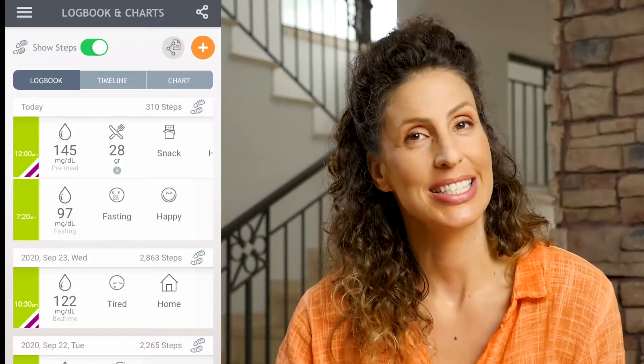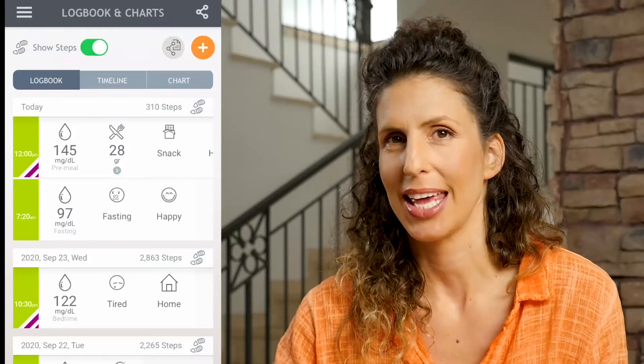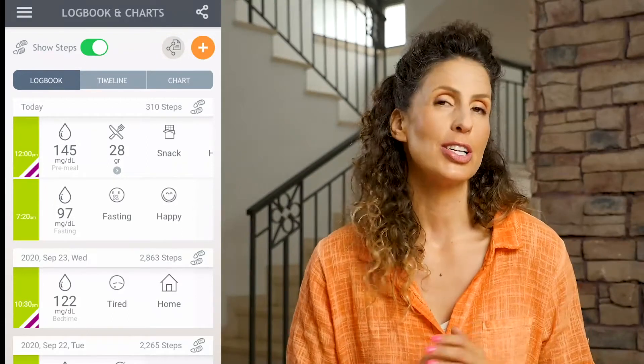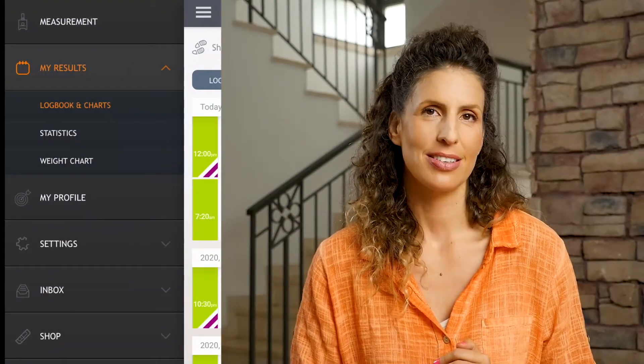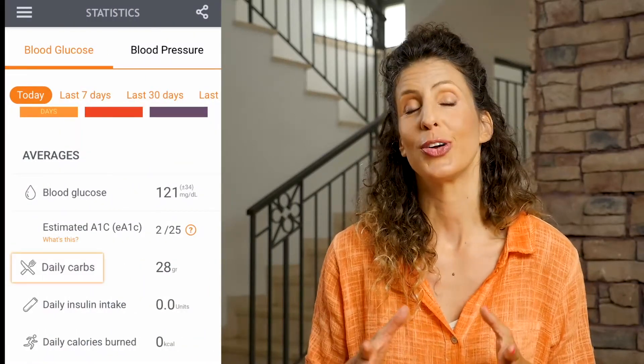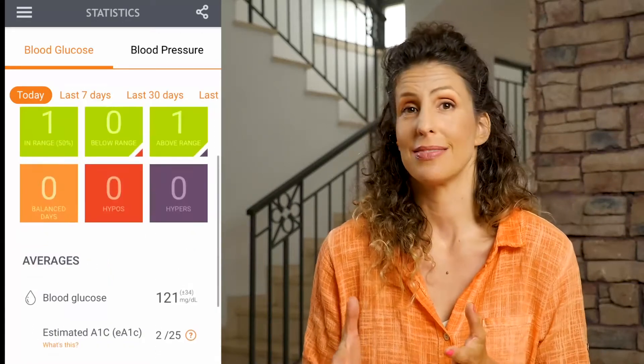While I'm waiting to take my post-meal reading, let's look at some other pages in the app related to carbs. Tap on the three bars on the upper left, tap on my results and then statistics. Among the array of useful statistics you can find your average daily carb intake. You can choose anywhere between today, last 7, 30, or 90 days.